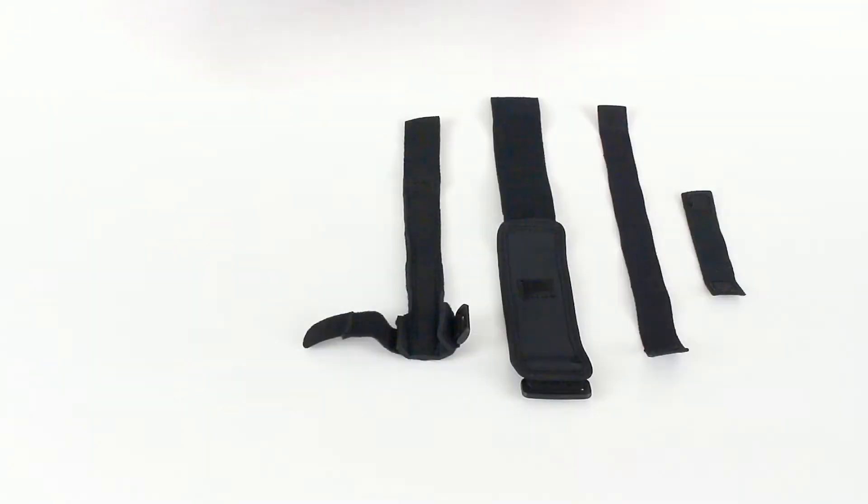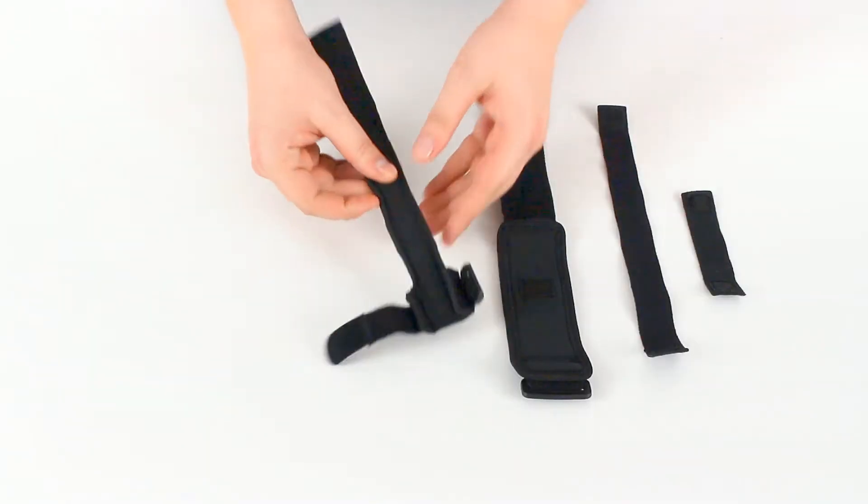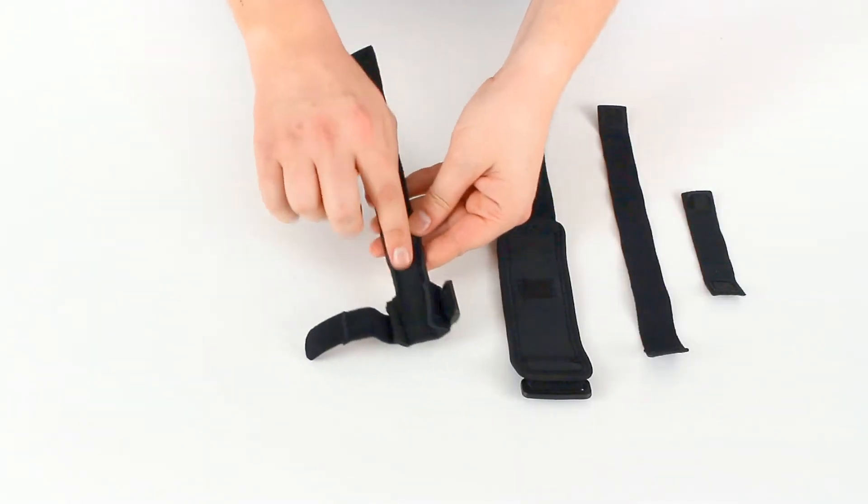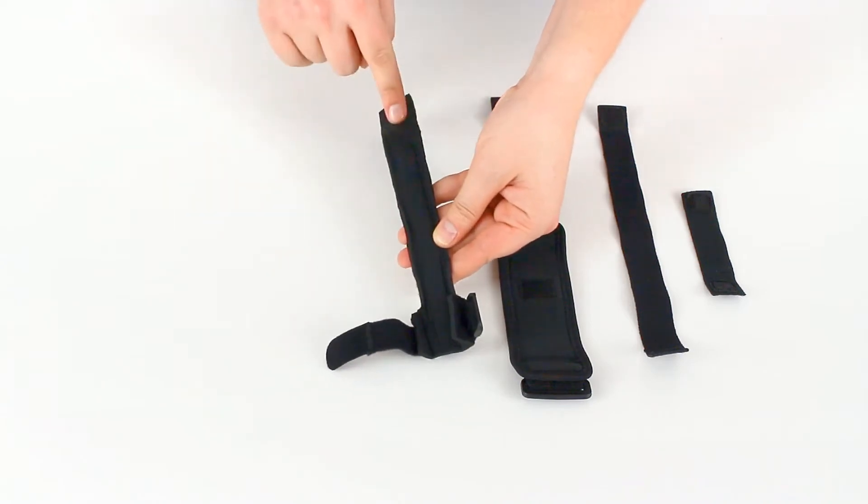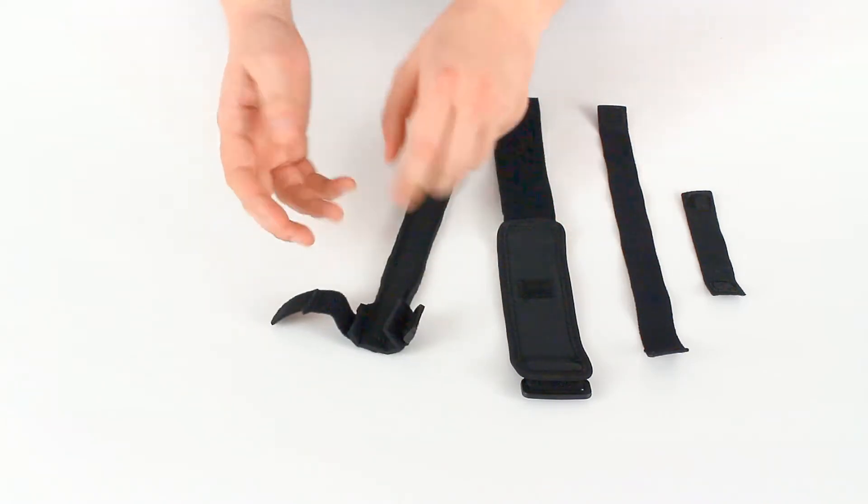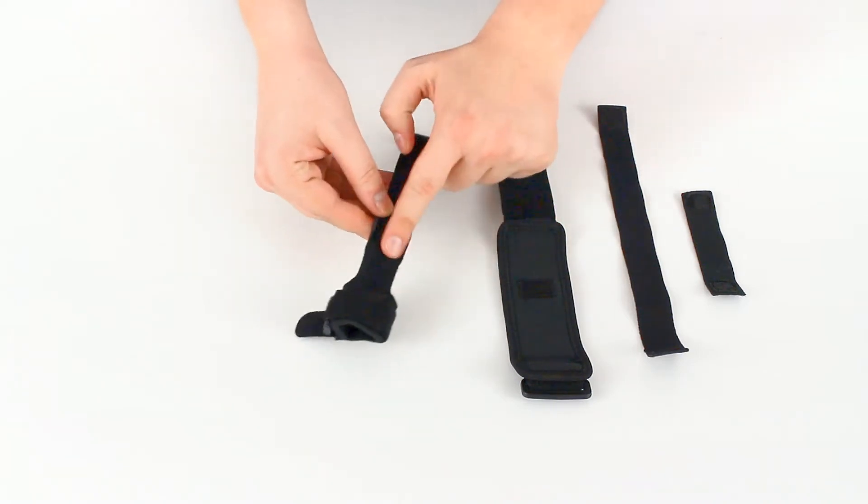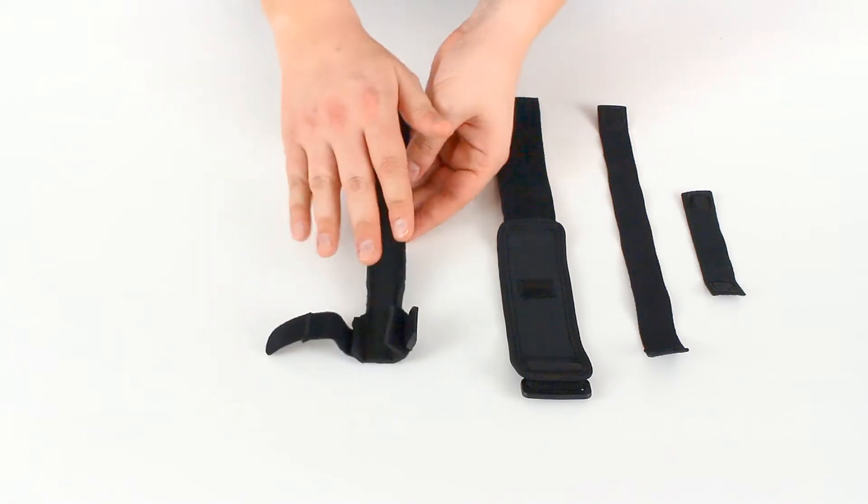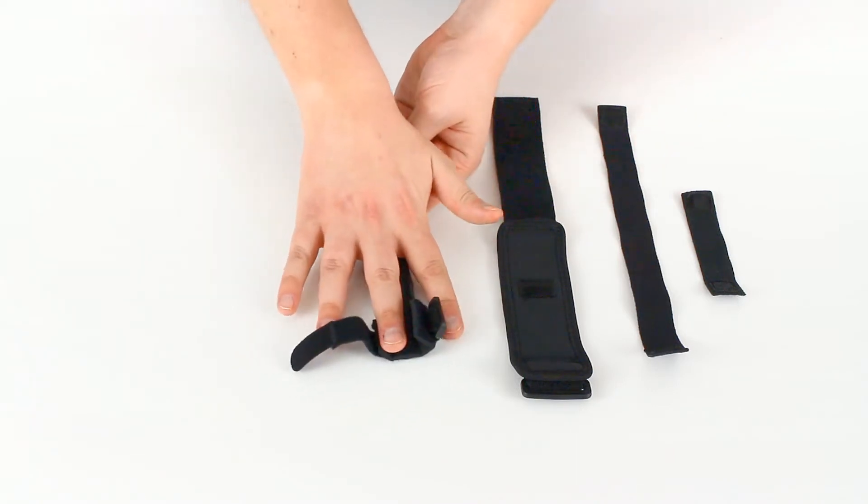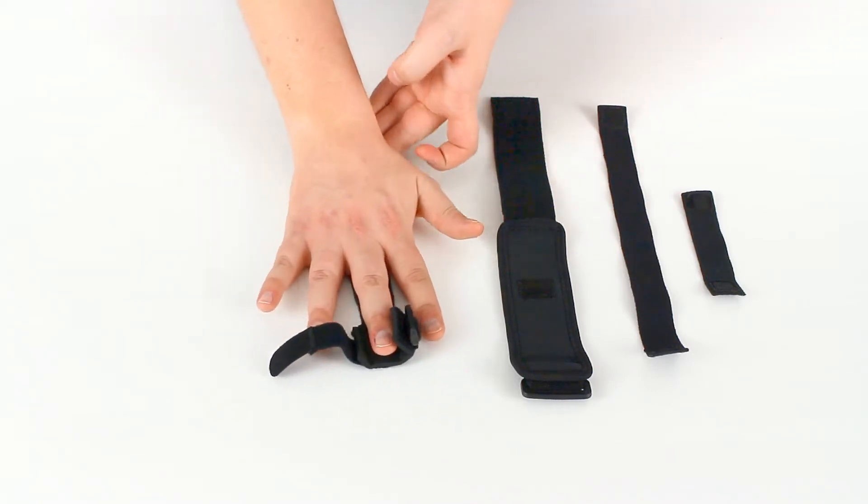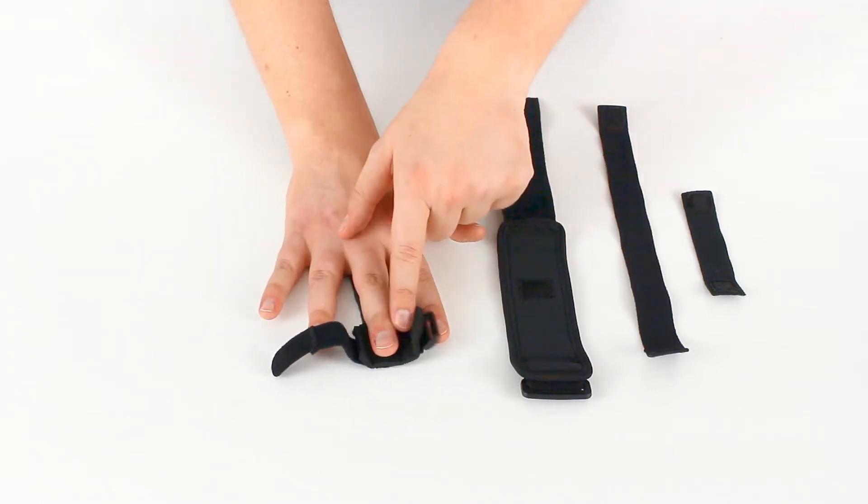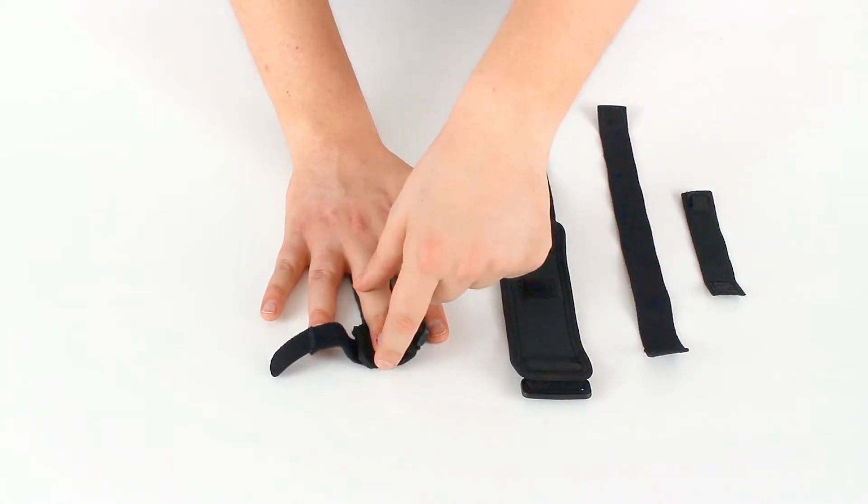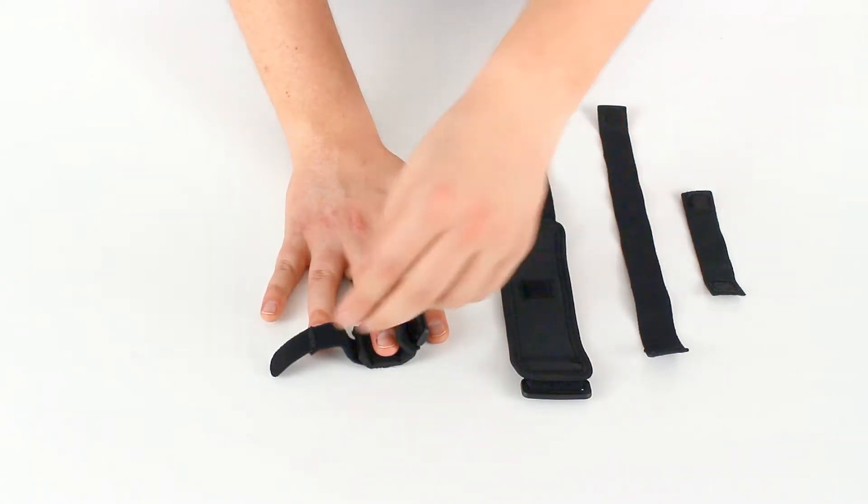We will start with the splint piece itself here. We want the smooth side of the fabric facing our palm. We want the rough side of the fabric facing away from our palm. So fit your hand in like so and get the finger you want to stabilize right to the end of the splint.